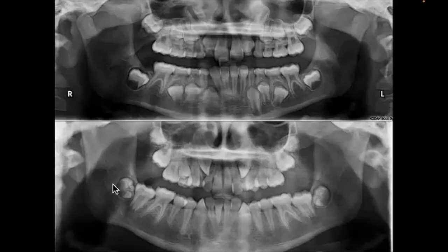Do you do a bite plate on your expander too in case like that? So I use bonded expanders, and so there is acrylic occlusal of the teeth, and so that opens up the bite there. So that's going to prevent wear while they're in treatment. So the short answer is no. Yep, and then once the expander comes out, then we'll put the retainer in that has the bite plate.